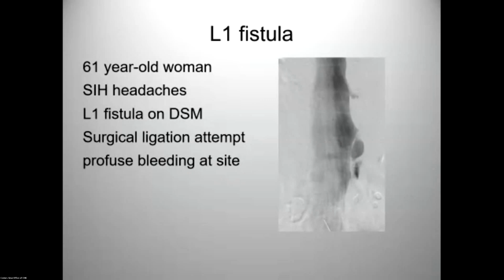I believe this is the last case example. This is a 61-year-old woman with SIH and headaches, L1 fistula on DSM. Dr. Shiving took her to the OR, but he encountered profuse bleeding. And so he closed up and then we got in.